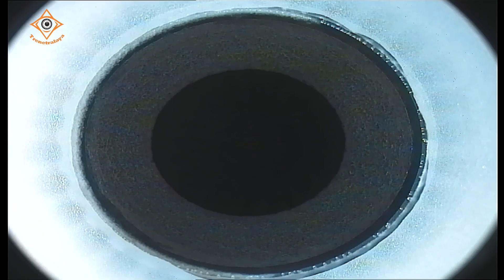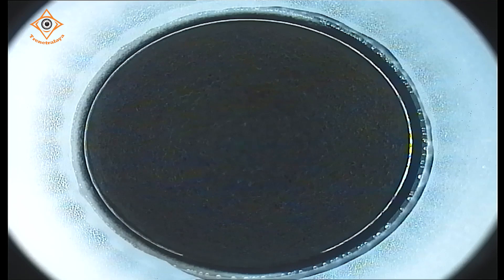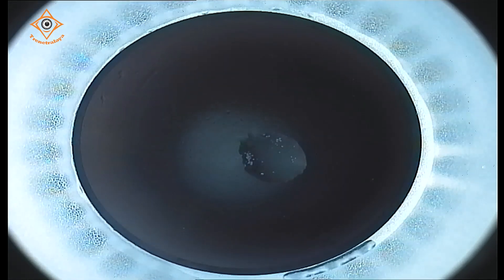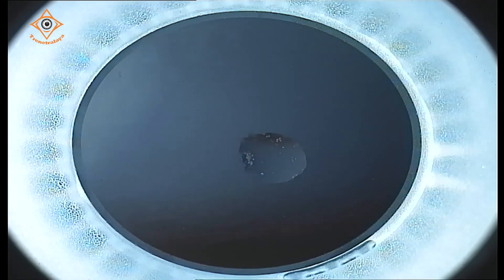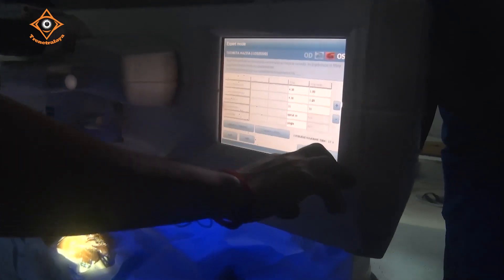We are starting the laser — asking the patient to stay still and look at the green light. This is how the laser comes in, finding the edge of the flap. This treatment lasted about 16 seconds. The best part is the patient is very comfortable with the VisuMax system because the pressure rise during the procedure is not very high, so the patient can still see the light and the procedure gets centered on the visual axis — that's an advantage compared to other systems.